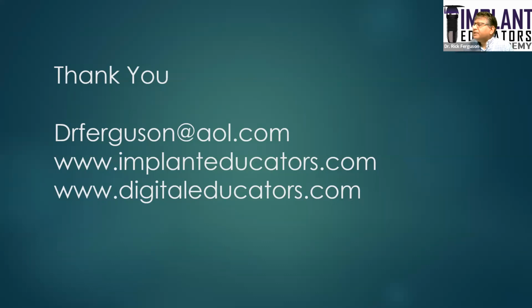So Pedro, if you're using a DLP printer, there shouldn't be any offset. The only time you should have to put in any compensations is if you're using one of the lower cost non-dental printers where you've worked out the settings on your own, or maybe you've gotten the settings off of our Facebook group. But you should not have to be putting in compensation factors for contraction. All of that should have been worked out by the manufacturer.